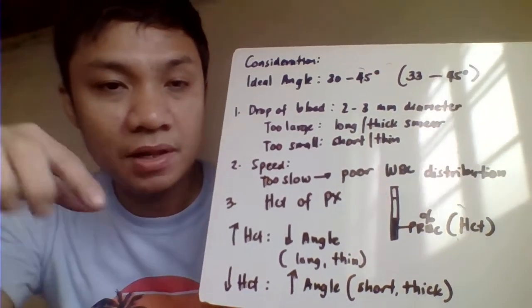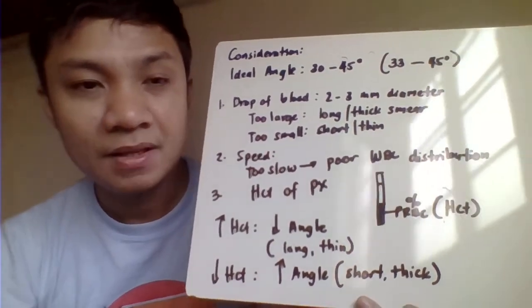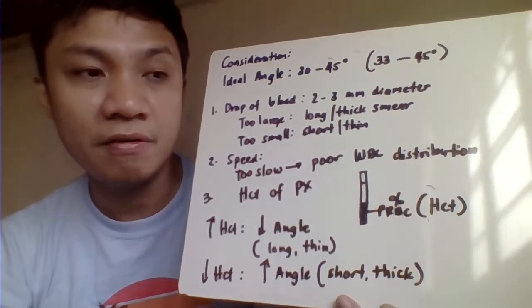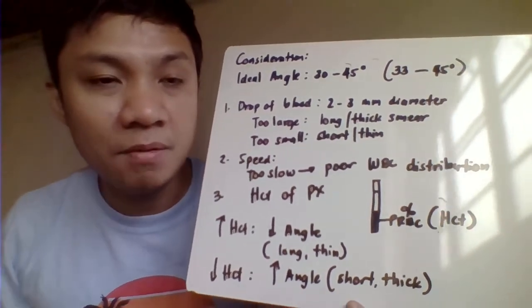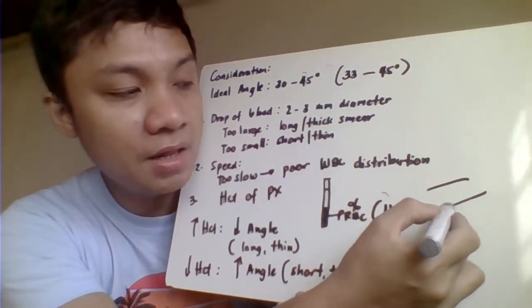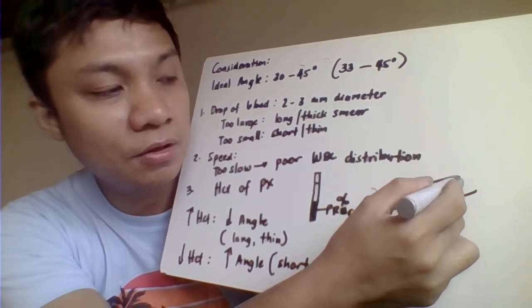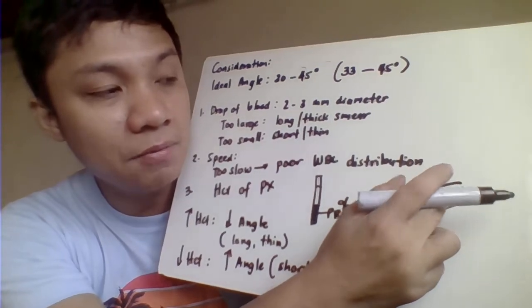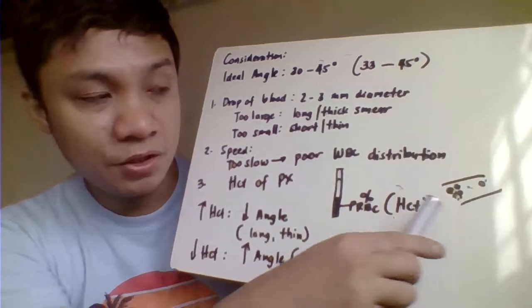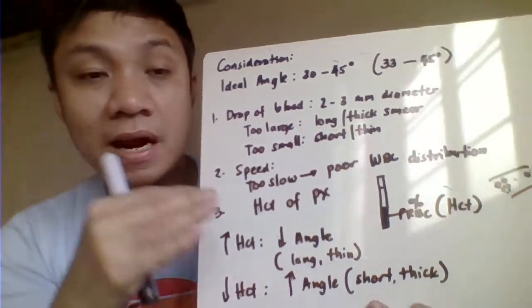Okay, then we have the speed of the spreader. So when you are making a film, it should be smooth and not too slow and not too fast. Too slow would result in abnormal WBC distribution within your film. What do you mean by that? When we say abnormal WBC distribution, in some part of your film you concentrate WBCs, in some areas there are no WBCs, and in others there are none. That's poor distribution of your WBC. You should have an equal or even distribution of your WBC throughout the entire film.